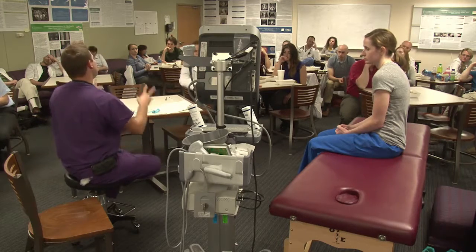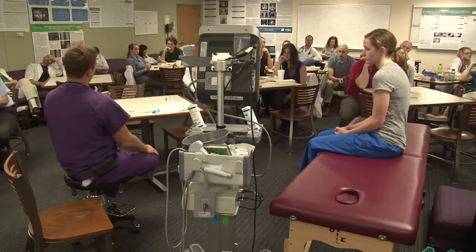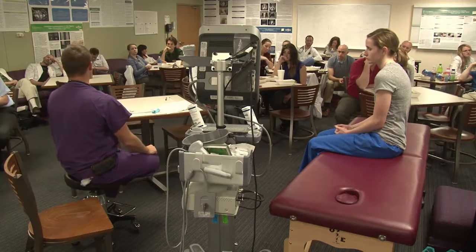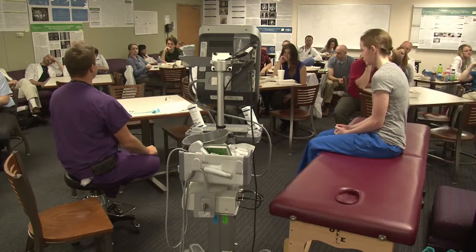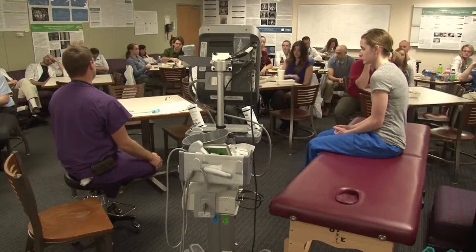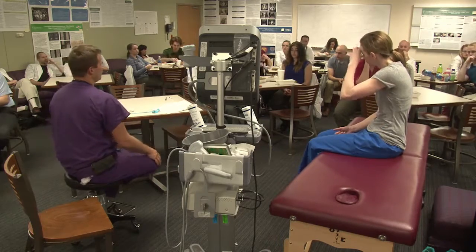Yes, you can't technically see your tip, but you know you're close. And so you can compare your ultrasound probe to where you went through the skin and how much slack am I going to have there for threading my catheter. That's one thing I would recommend. And that's easy for me to say because we do it a lot, right? So.